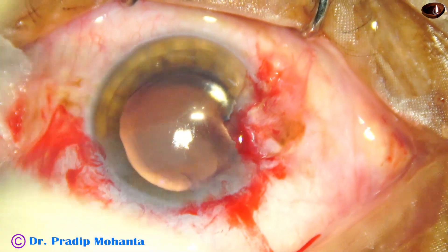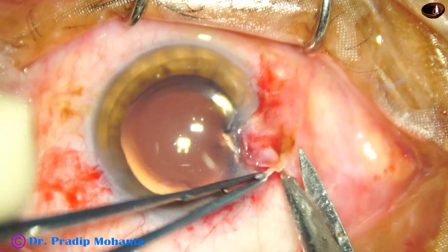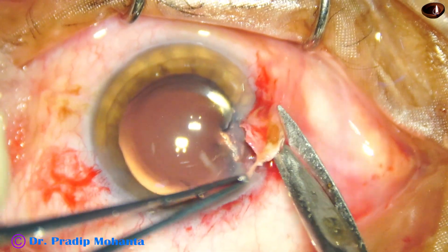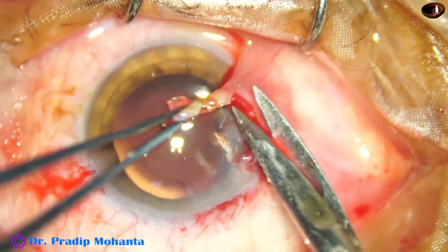Now I take a Vannas scissor and forceps and trim the pterygium. The thick, unhealthy pterygium is excised. The healthy pterygium is not sacrificed.